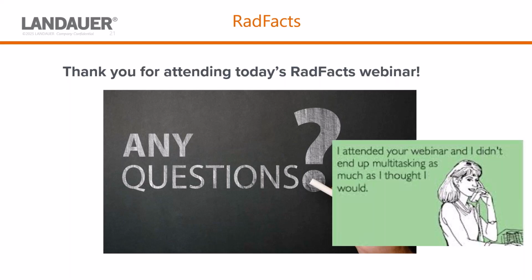Can we modify ALARA levels to our own chosen thresholds? Yes, the ALARA levels are set by default, but if you have specific ALARA levels that you want to set by account or sub-account, please reach out to your Landauer customer support person, and they can set those directly for you.